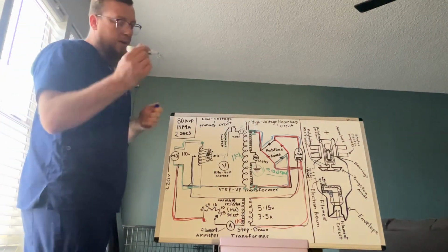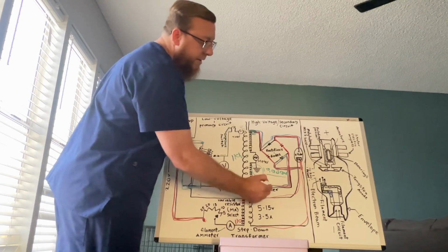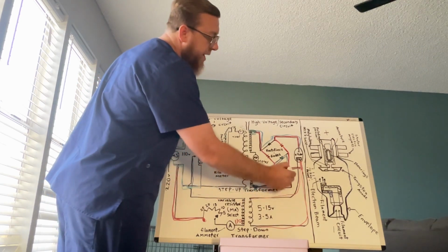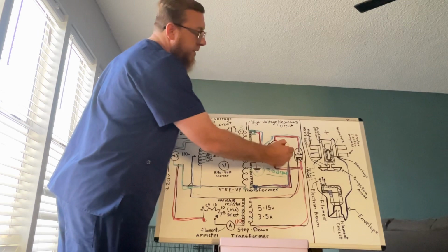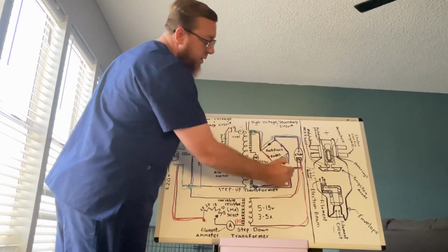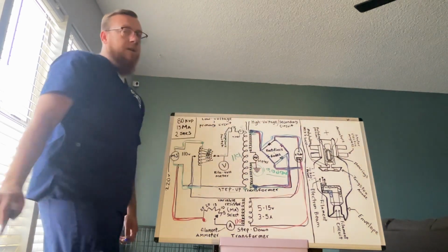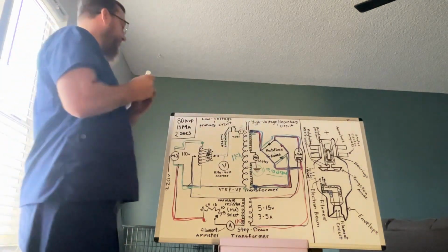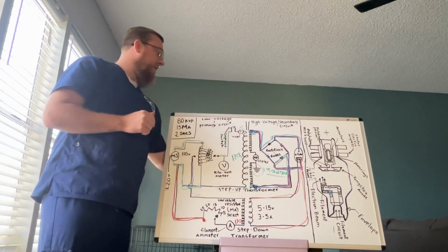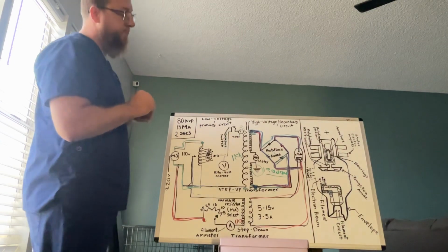The first way, follow my marker. We're going to start down here. It's going to go through the rectifiers, up through the anode, out the cathode, to the top portion of our secondary. After that happens, our secondary one's going to start, and it's going to go in the opposite direction.